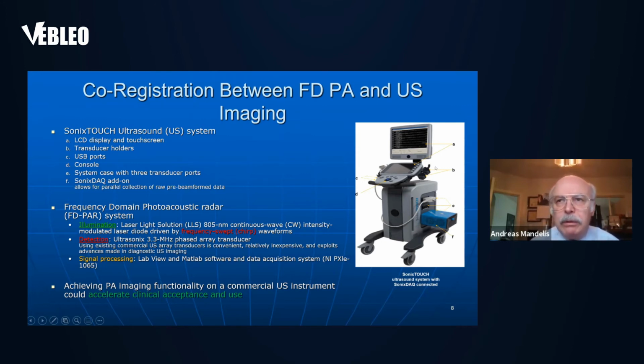So the advantage of using this kind of an imager and using the frequency domain is that for these commercial medical imagers, the frequency domain is being used. There is actually a frequency signal that goes out by the ultrasonic transducer to the patient, and then the transducer and the system pick up the response back from the patient. So this is already in the frequency domain. It's just like the frequency pulse is lasting for a certain amount of time, and then it's cut off. So you have the pitch-catch kind of system of signal generation and response.